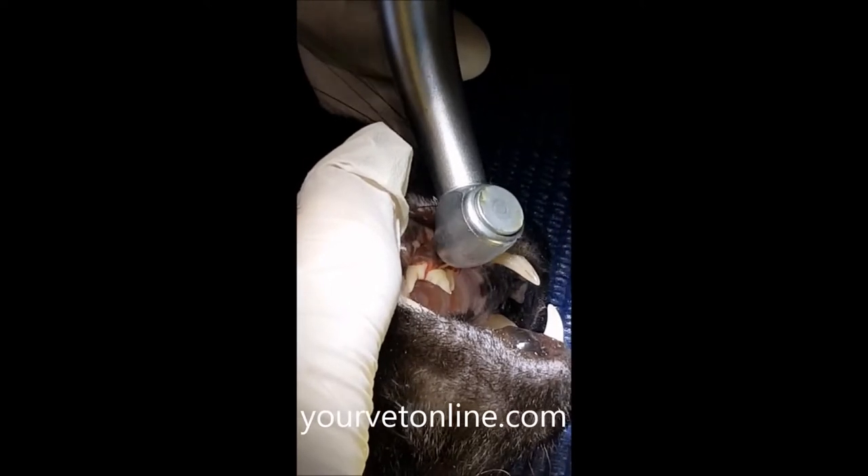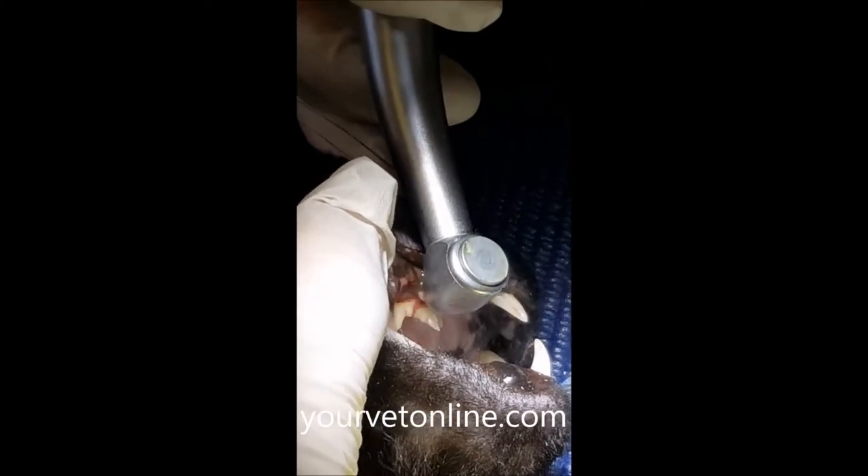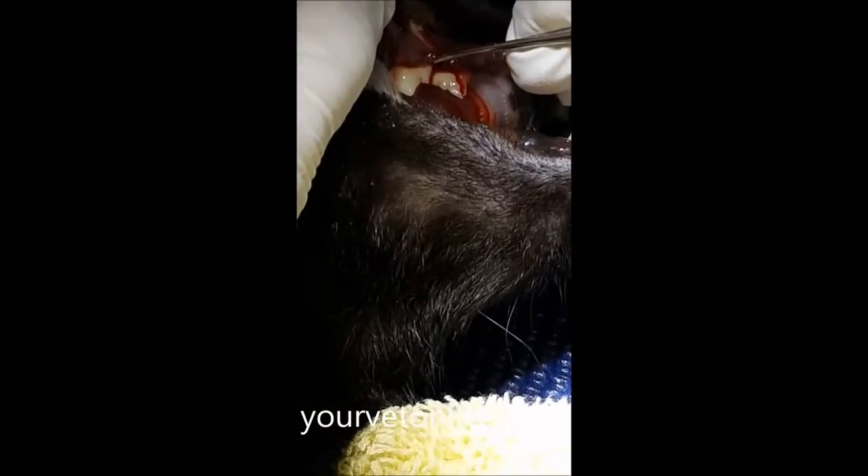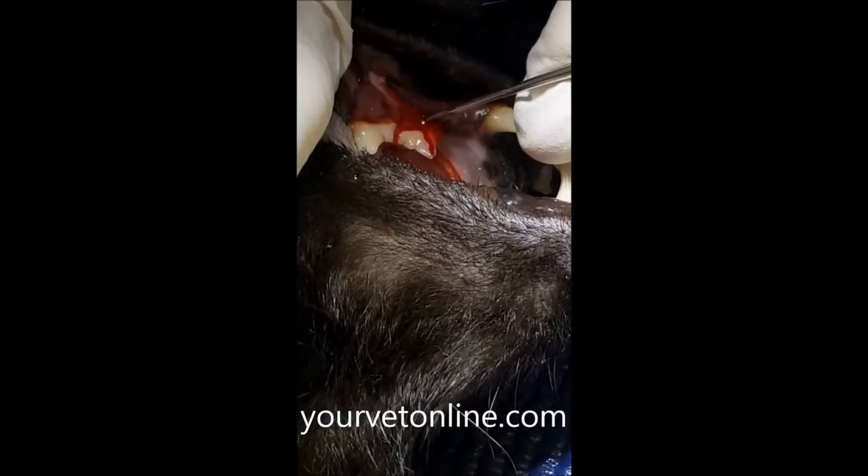Here, what we can see is the tooth will be sectioned off with a high-speed cutting bit. This allows us to separate and work on each root individually.